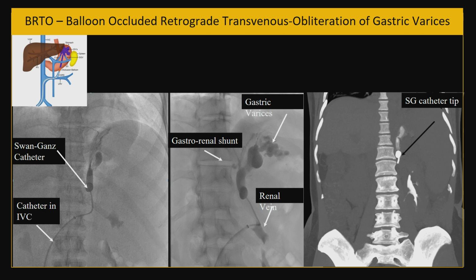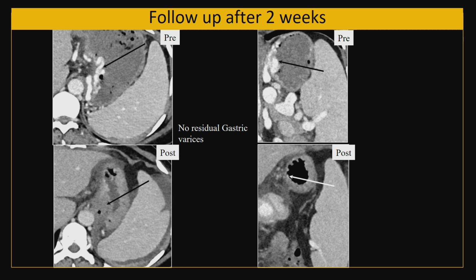And this is the follow-up CT after 6 hours. We have kept our balloon for at least 6 hours to obliterate all those varices. And this patient did very well. And this is the follow-up CT after 2 weeks.